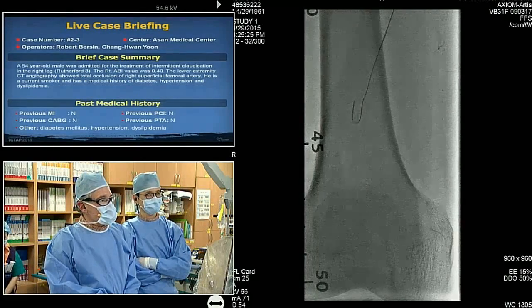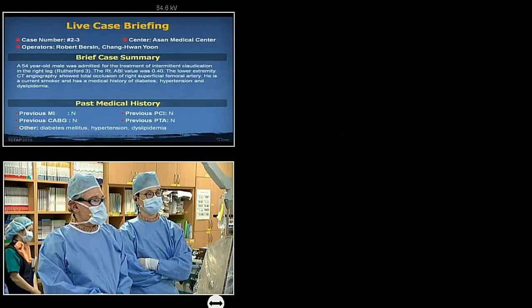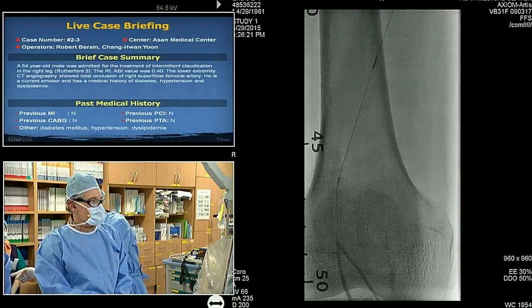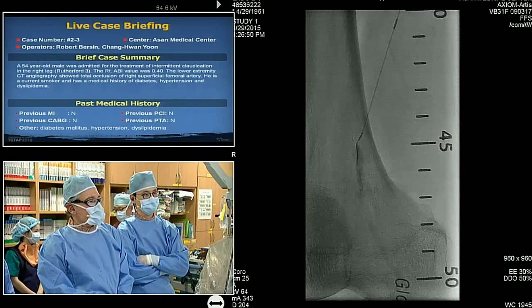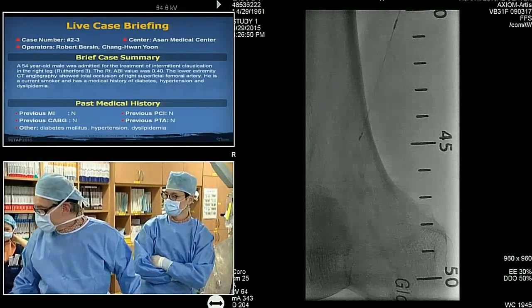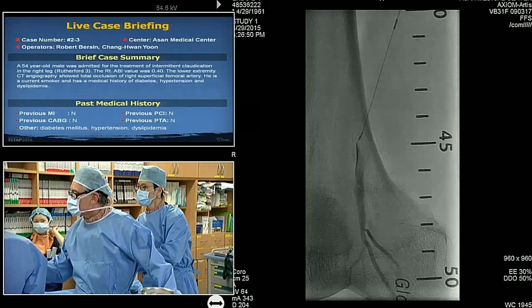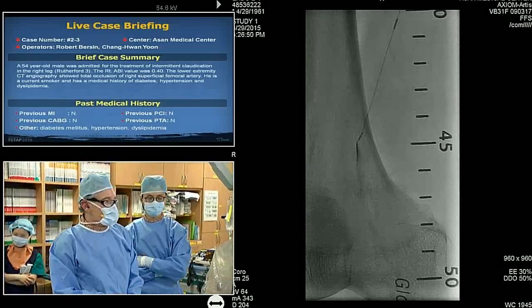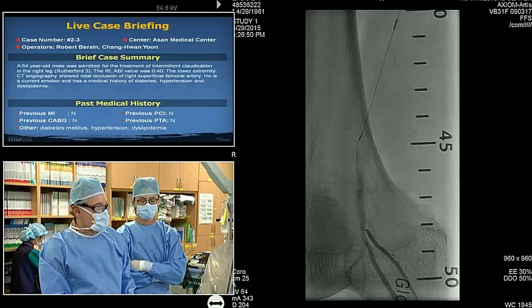All right, so here's our distal injection. The wire's headed down. If you go to the next. So we do a distal injection, which was a little distal into a geniculate, so we pulled back slightly. And here we are. So we're across the lesion. Let's go ahead and now have the Grand Slam wire. Oh, fine. Yeah, we have just a supportive guide wire. So we're across the occlusion. Now it's open for discussion what to do with it. So I'll open it to the panel.